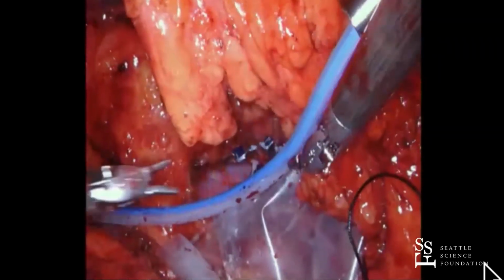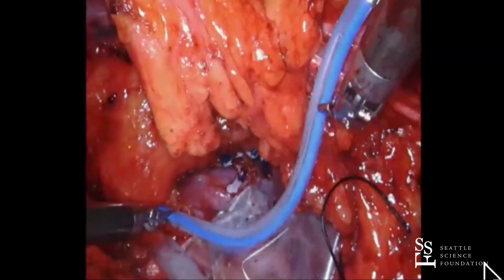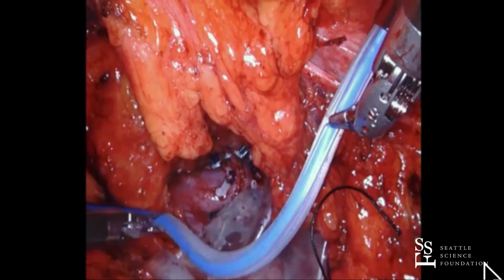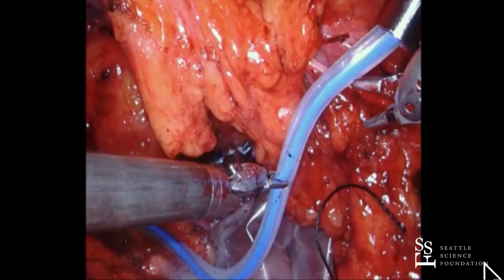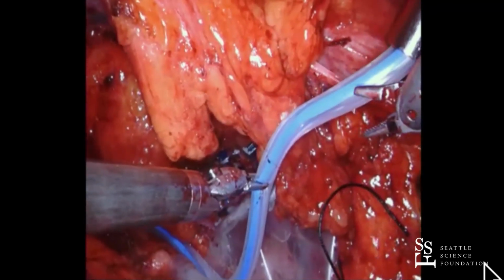So you don't keep the patient asleep during that time in case you need to go and take more, do you? No, I don't, because I looked at the margin grossly. I'm fine with it. I didn't get in the tumor. I think we know that just from our view, and we don't keep the patient asleep for that.